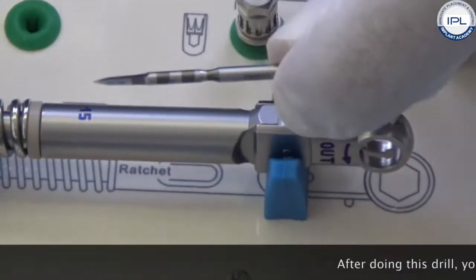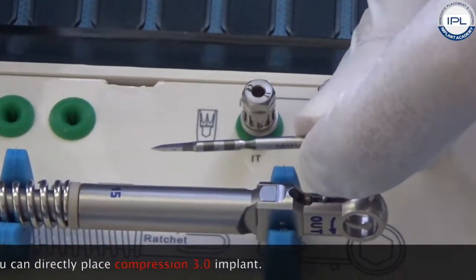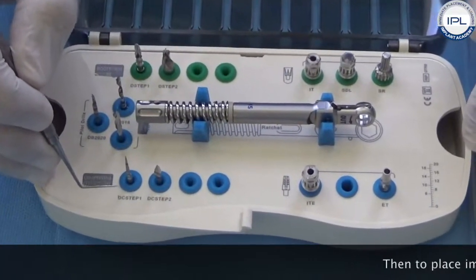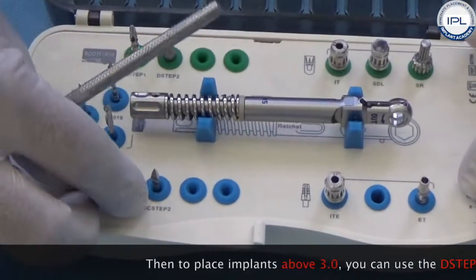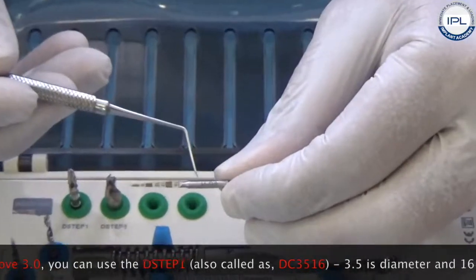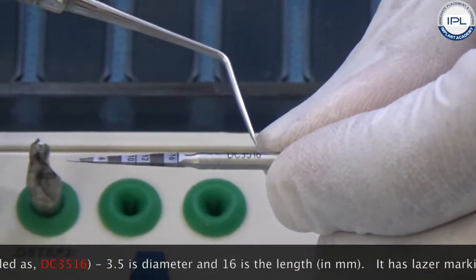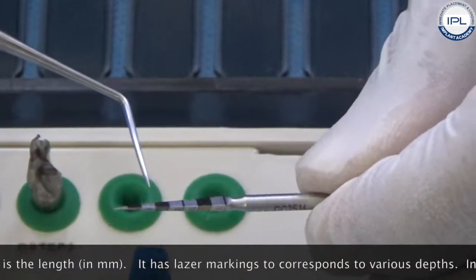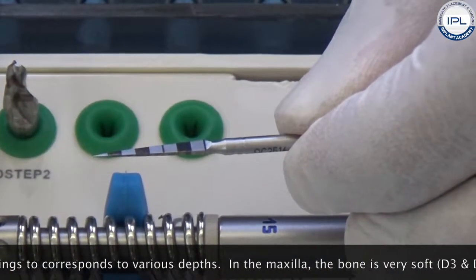This is your first drill. After doing this drill, you can directly place your compression 3.0 implant. To place implants above 3.0, you can use the D-step 1, also called DC 3516 — where 3.5 is the diameter and 16 is the length, that is 16 millimeters.